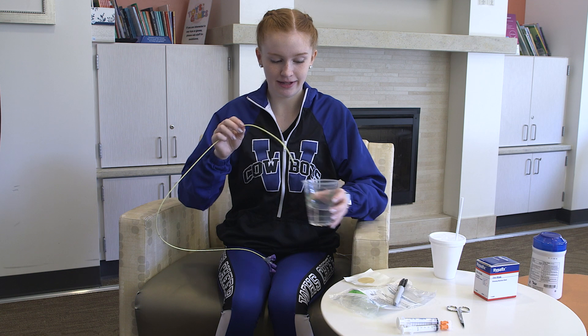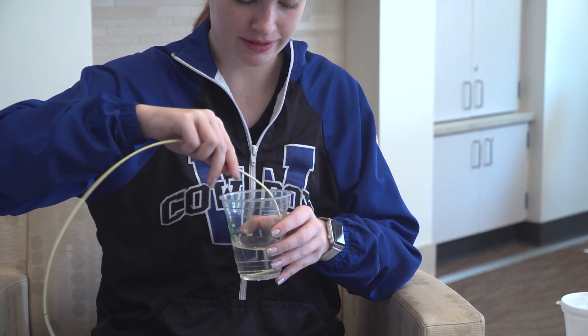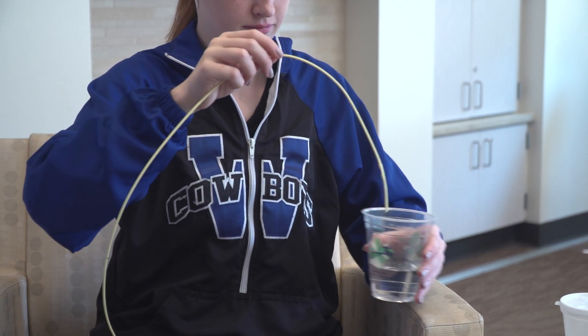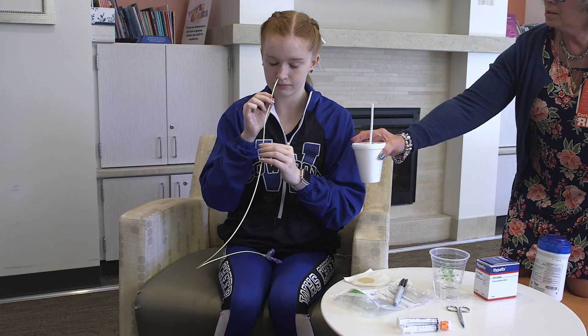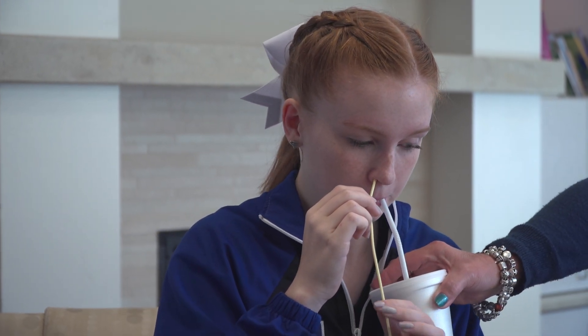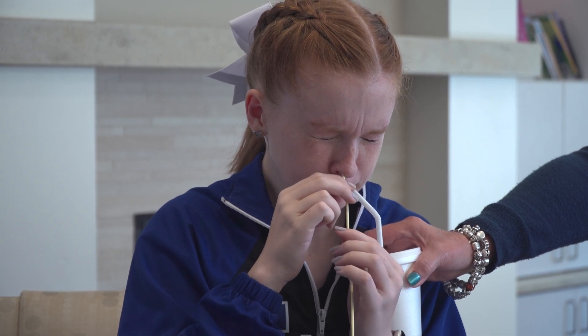Next, lubricate the tip of the tube by dipping the tip in water to prevent the tube from clogging. Do not dip the tube into gels or Vaseline. Finally, insert the tube through the nostril until you have reached the mark on the tube that you made with the pen or marker. It may help to offer your child drinks of water or sucking opportunities.